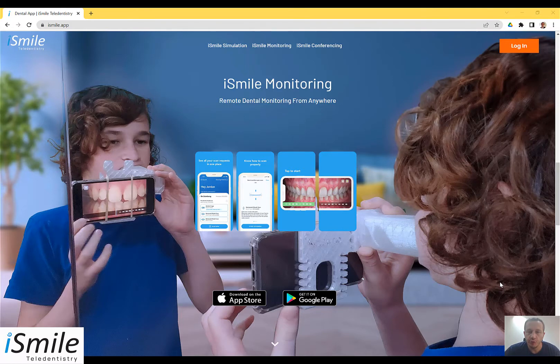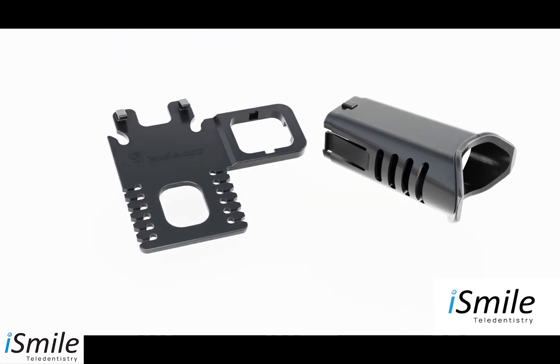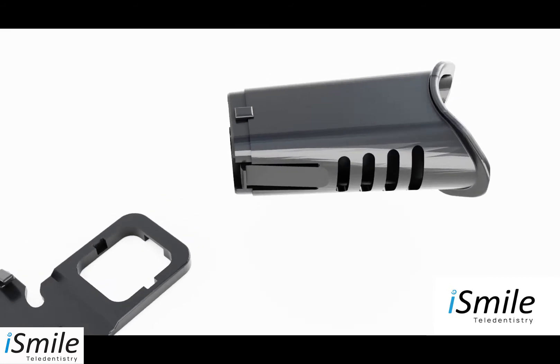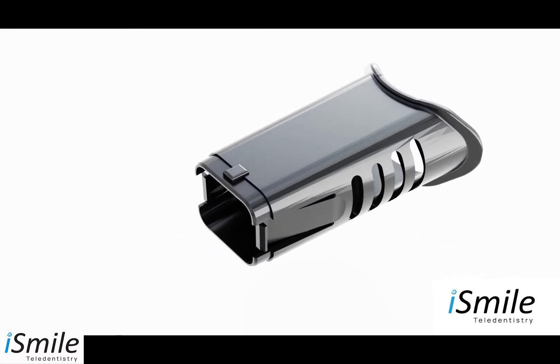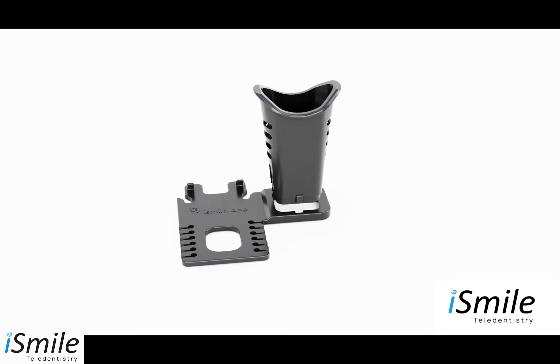In order to perform a scan you will assemble the remote monitoring scope and attach your cell phone. First, place the flat part of the scope on a flat surface such as a table with the side with the brackets facing up. Next, squeeze the clips of the scope. Then align the bulges on the scope with the indentations on the flat piece and insert the scope until you hear a clicking noise.